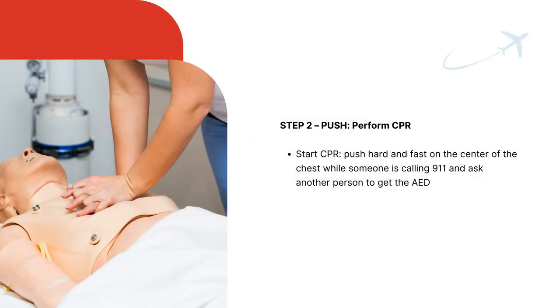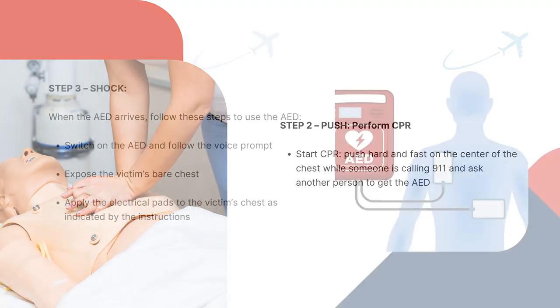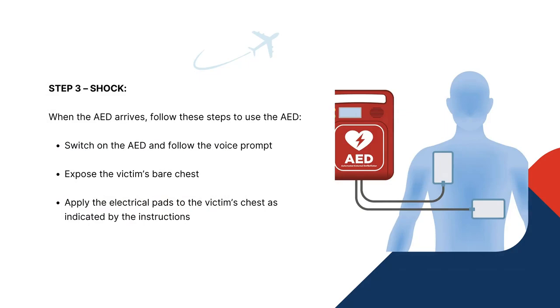Step 2. Push. Perform CPR. Start CPR. Push hard and fast on the center of the chest while someone is calling 911 and ask another person to get the AED. Step 3. Shock. When the AED arrives, follow these steps to use the AED.